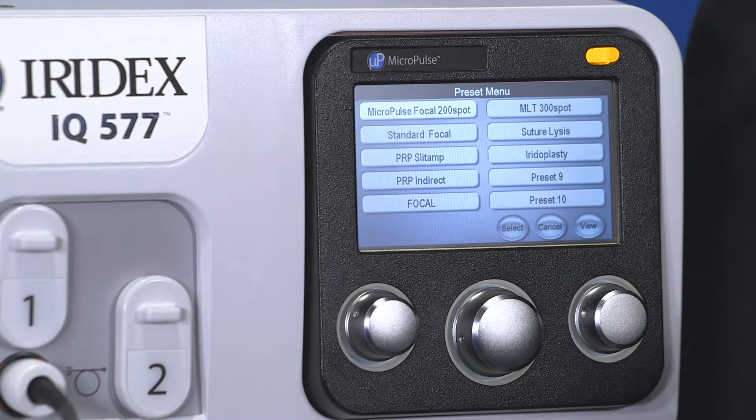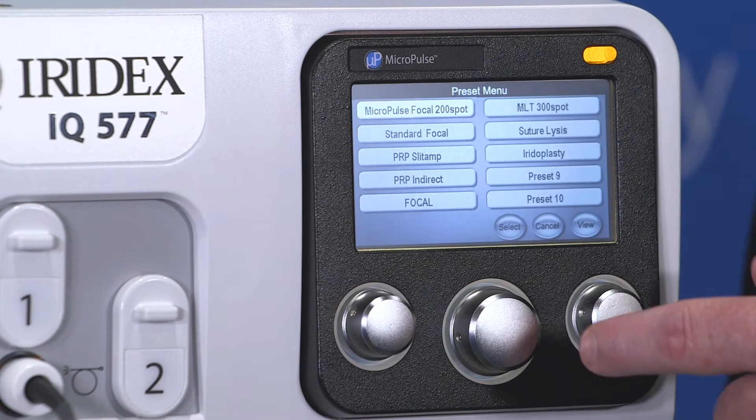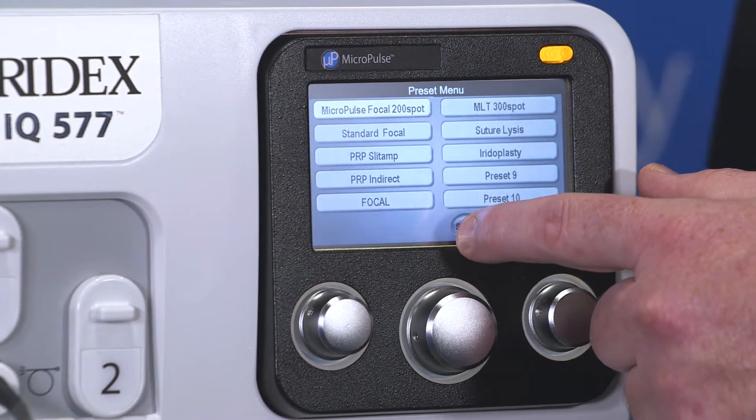Once the laser is initialized, the first step would be to select your preset. Here we'll be selecting MicroPulse Focal. You would select MicroPulse Focal and then press the select icon.